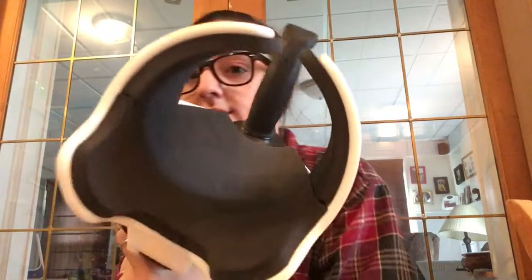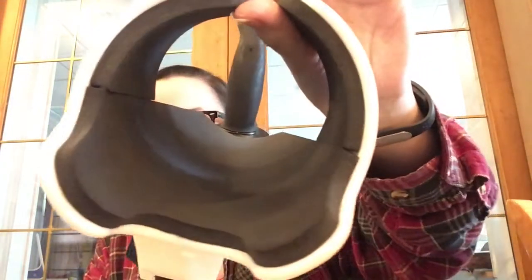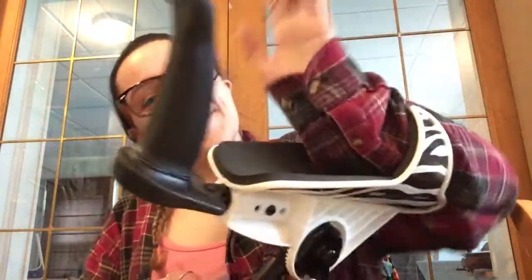Alright, so I have foam on both sides now. And no matter how hard I try, it still sticks up right here. So I don't really know how much better. I mean, obviously here I could have done better, but this one I got down pretty well, and it still sticks up a lot. Just not quite as much. But I love it. It's great. My arm feels more snug. And, best of all, I don't drop it when I let go of it. So I have use of my hands if I need to grab something. And it still pops off if necessary.